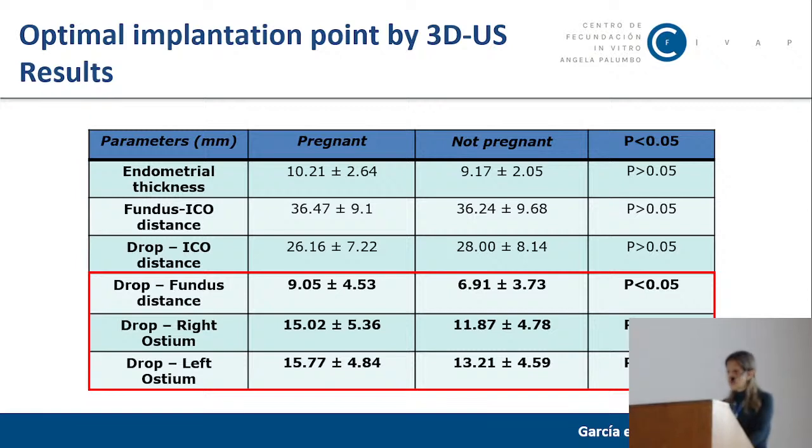Based on this study, we have modified our embryo transfer technique with the intention to deposit the embryo, the drop, as close as possible to this ideal maximal implantation point.